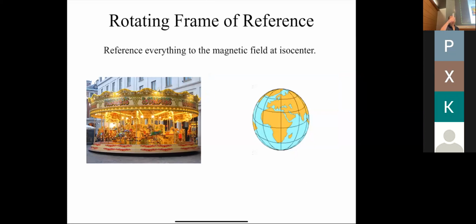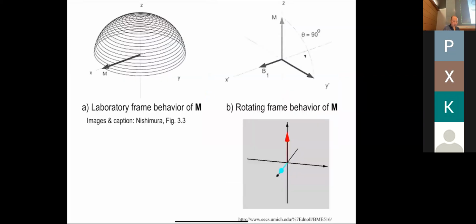So it's sort of confusing to think about things spiraling down all the time. Just to remind you, we will be doing everything in a rotating frame of reference. Everything we do in this course, basically from now on, is in a rotating frame of reference when we're looking at MRI equations. So instead of this complicated picture where we have to imagine the spin spiraling down, we can just imagine that here's the B1 field, pointing this way. The precession is going that way, so my thumb is pointing this way, and it's going to cause a precession around that B1 field. That's what gives this flip angle.